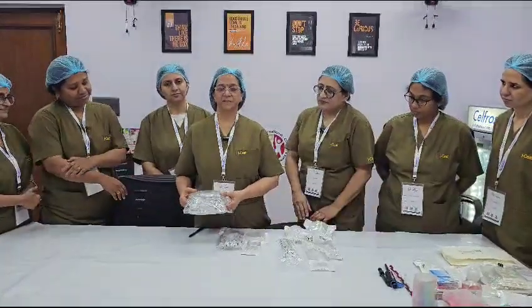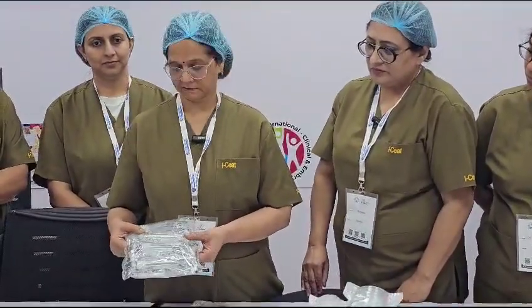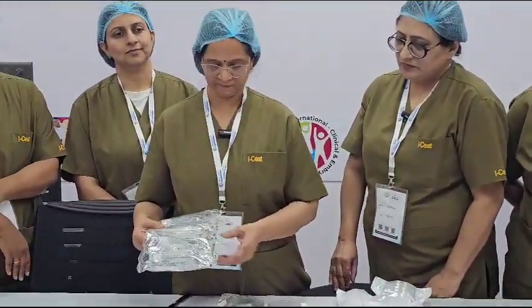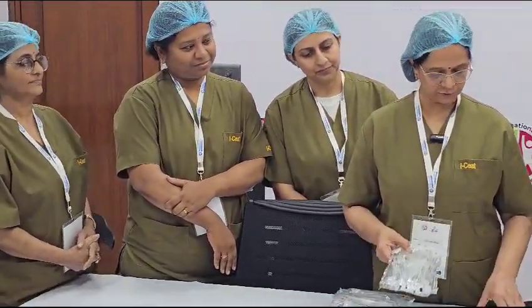Good evening. I am Dr. Pratima. What do I use in IVF plastics? This is a 14 ml test tube, and this is a 5 ml tube.